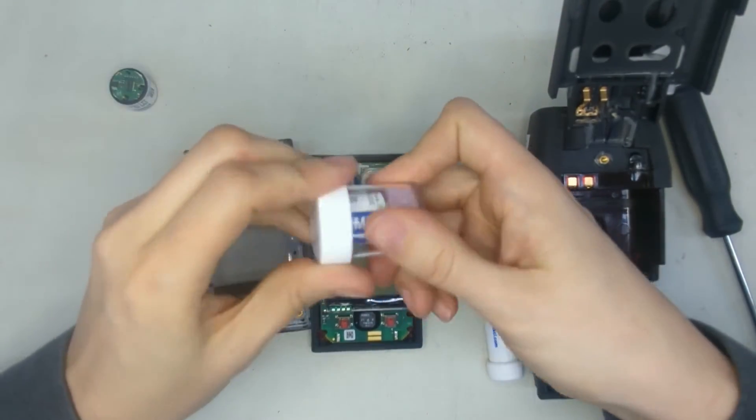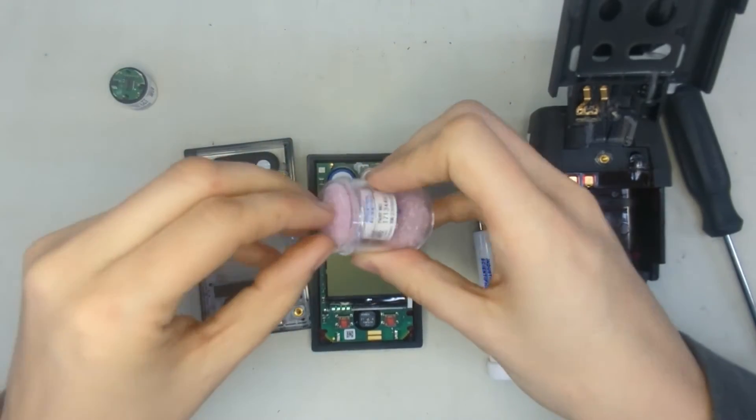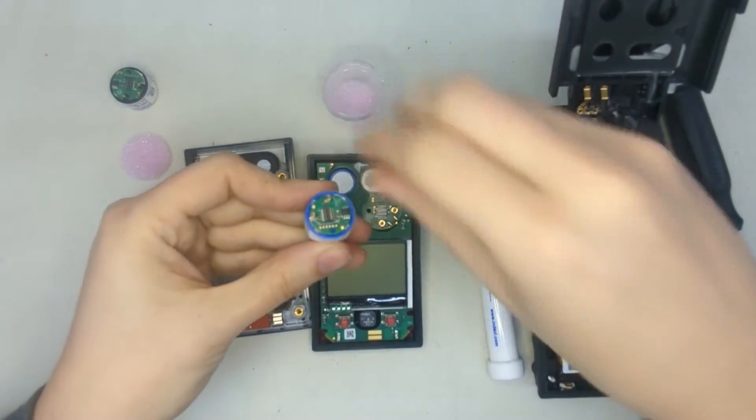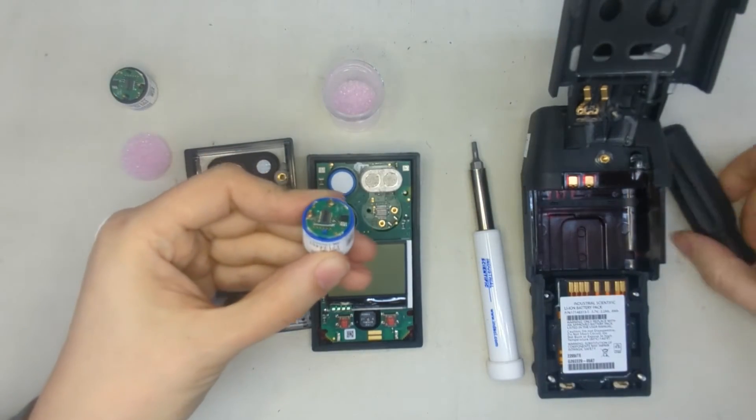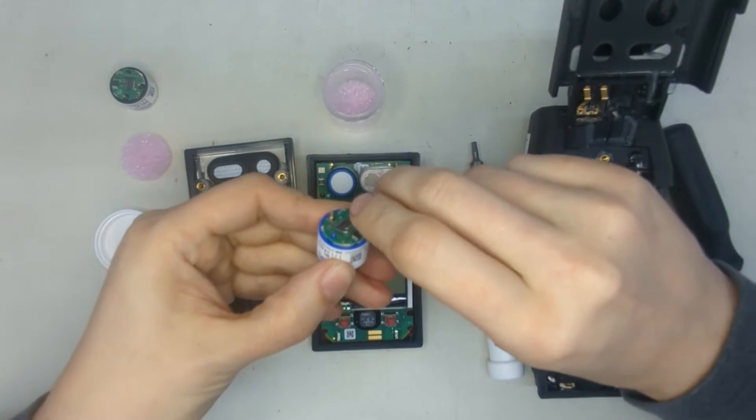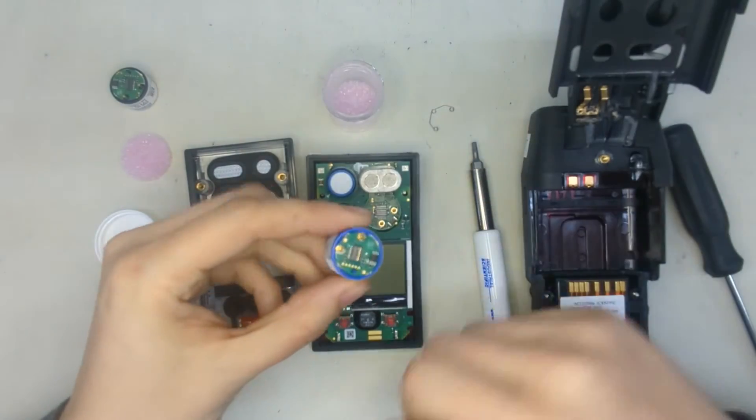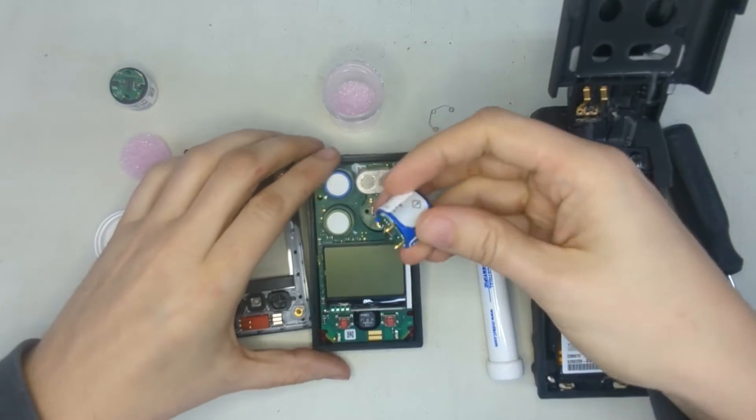We're going to go to our new sensor here, open it up. Now this part is very, very important. You have to remove this shorting clip right here on the bottom. So all you need to do is pop that right off. And if you don't do this, the monitor won't function properly. So make sure you do it.